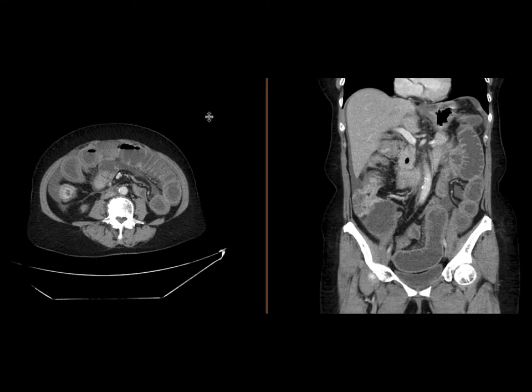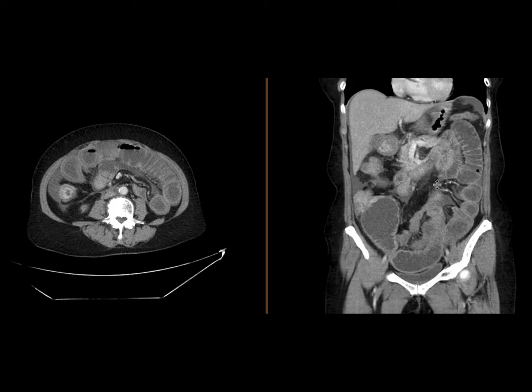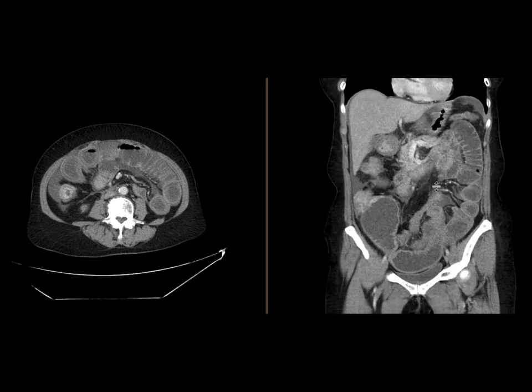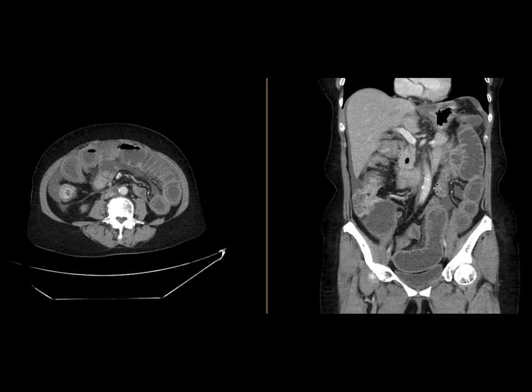Differential possibilities for this include a potential adenocarcinoma, although the hypervascularity would be unusual. A carcinoid tumor could also be considered, although the length of this would be a little bit longer than you would expect for a carcinoid tumor. This patient has a history of breast cancer, and this turned out to be a breast cancer metastasis to the bowel, resulting in a small bowel obstruction.